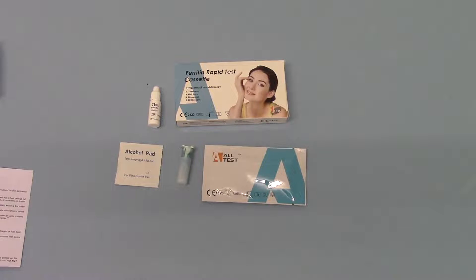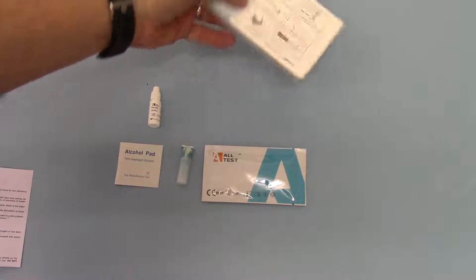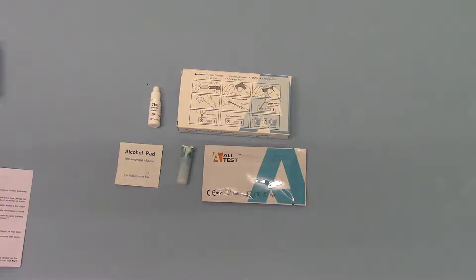Your result shows in the test window within 10 minutes. It's a straightforward positive or negative result for ferritin. On the back of the pack there are simple instructions and guidance on how to interpret your results.